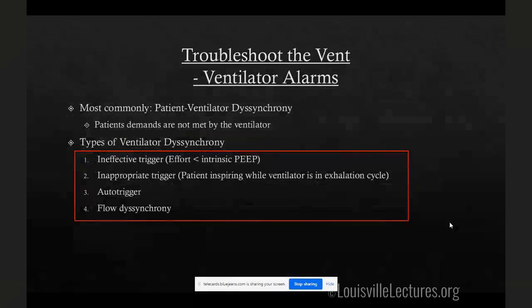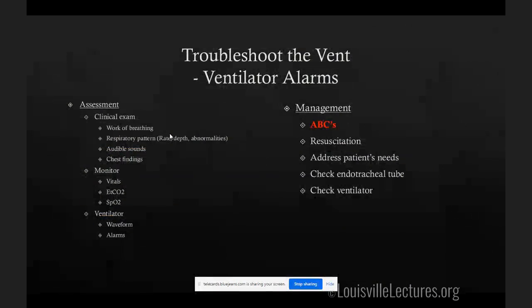As far as alarms are concerned, this is more of a fellow level thing. But what should you know as becoming interns and senior residents? Always think about your ABCs: airway, breathing, circulation. Is the patient stable at that point in time? If so, you have time to think.